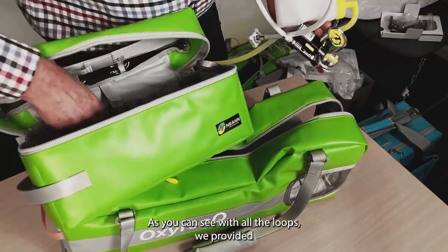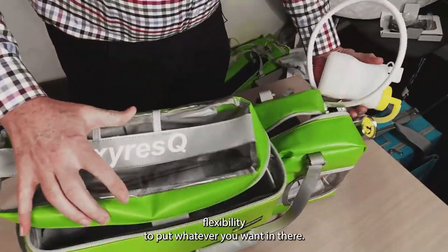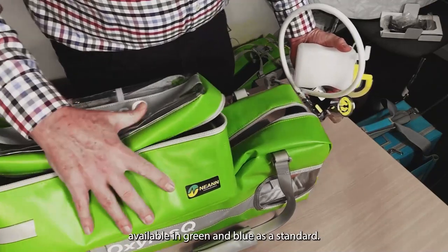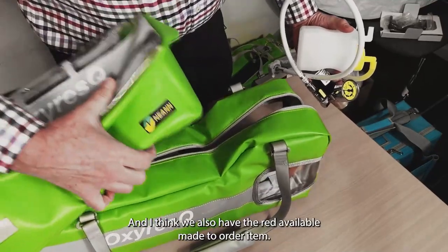That's a quick run-through of the Oxy Rescue — probably one of our most popular bags, available in green and blue as standard, and I think we also have red available as a made-to-order item.